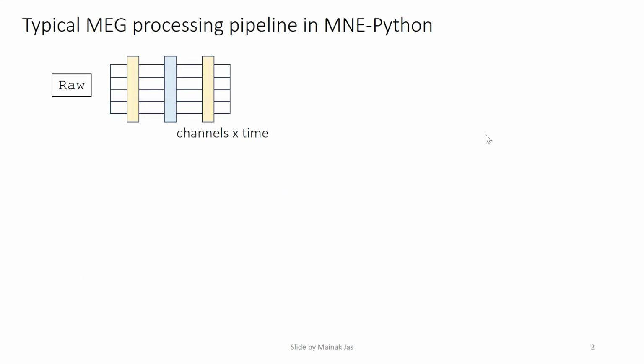Let me begin with a very short overview of a typical MEG processing pipeline. Probably many of you are familiar with it, but it doesn't hurt to repeat it.